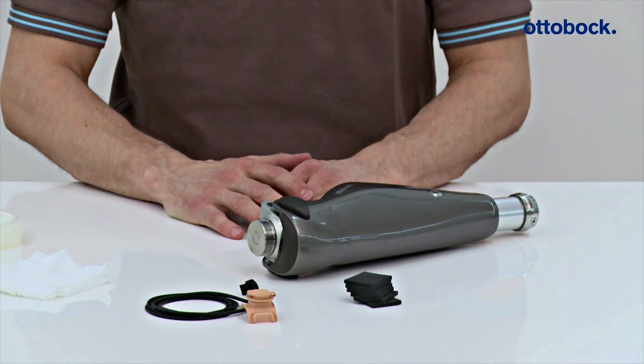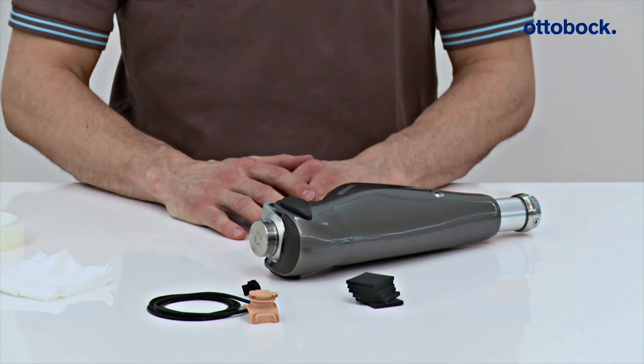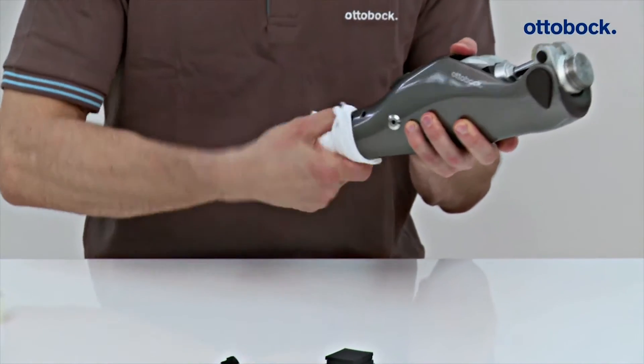After the O&P Professional has determined the position of the charger extension cable together with the user, the tube is cleaned at the specified position with a damp cloth and mild soap.